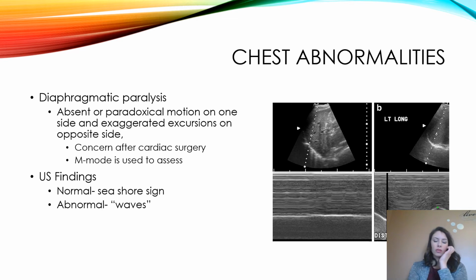Normal findings, as you can see, you should be able to see movement with breath of the diaphragm, and it should look like, you can't really see it, but there's movement. You can tell that there's movement right there. It's not just stagnant.